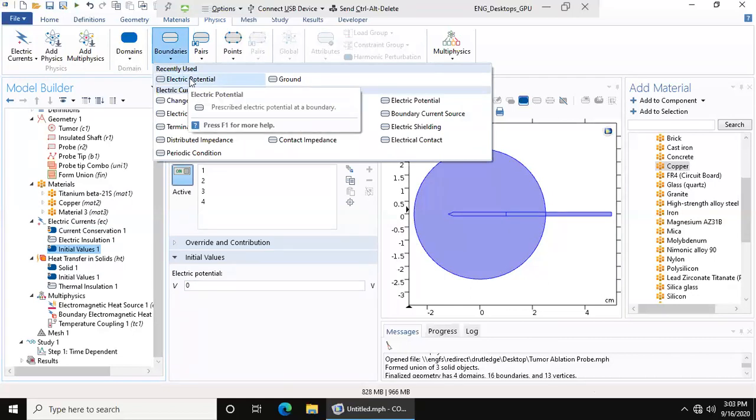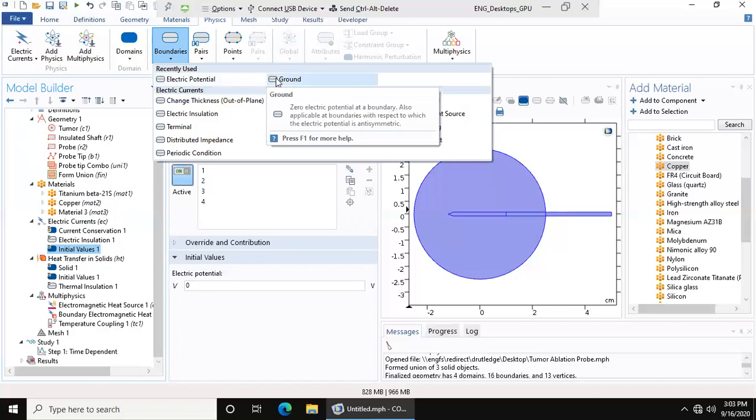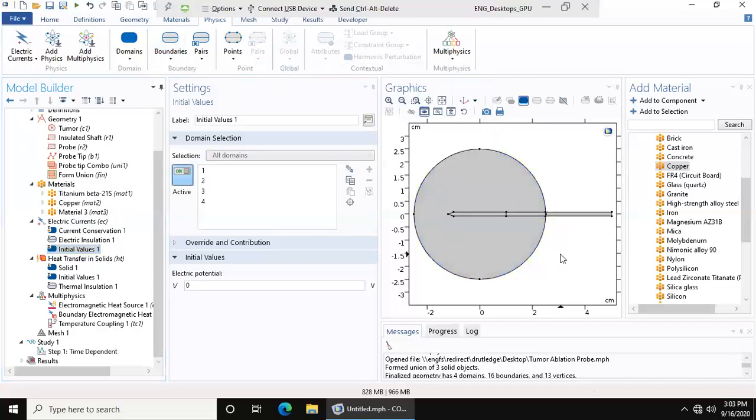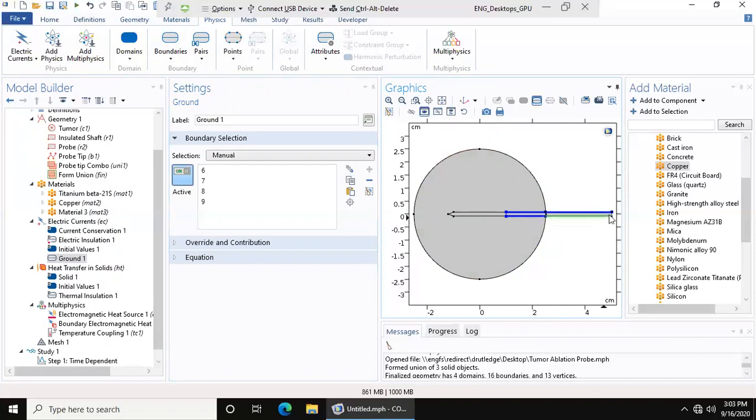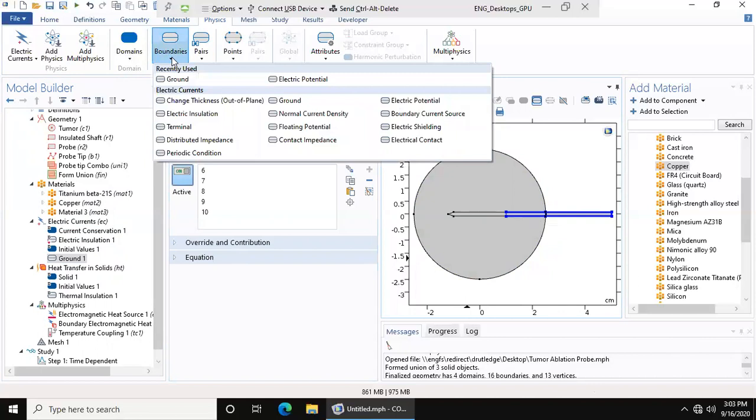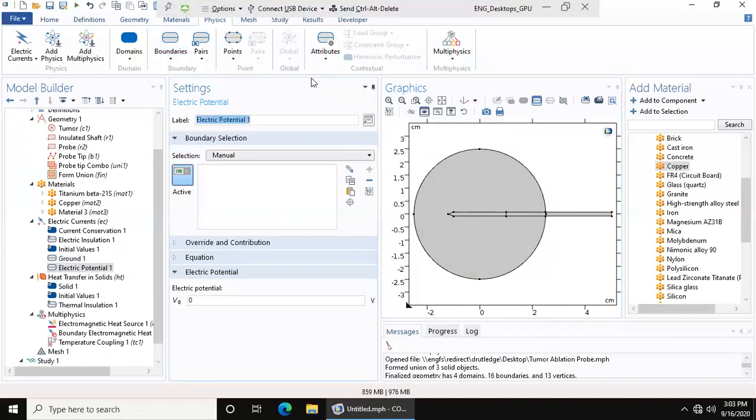First thing we want to do is add our ground. We're going to make all of our insulating boundaries our ground just to make things easier, simple enough, because there's going to be no current going through the insulating shaft, so we're just going to make it into a ground.